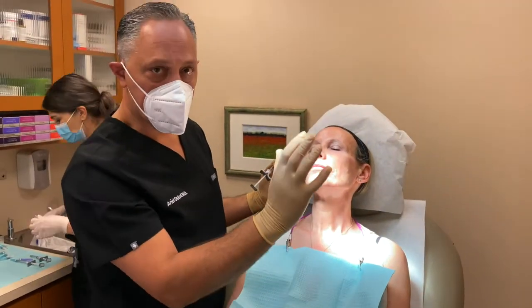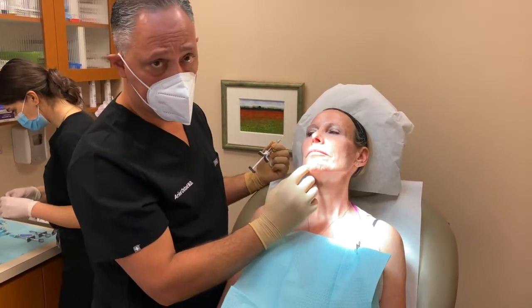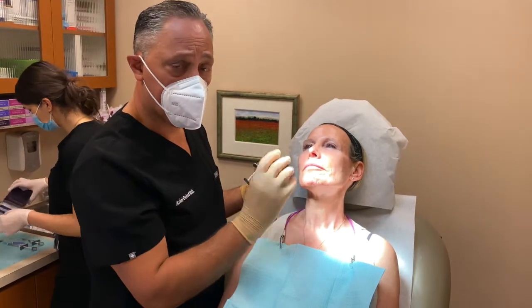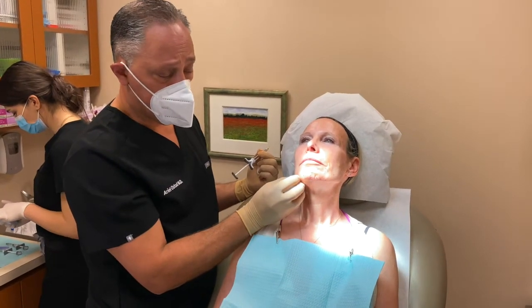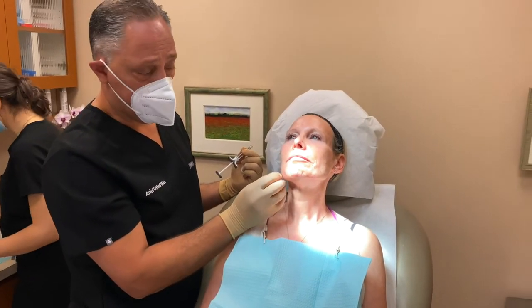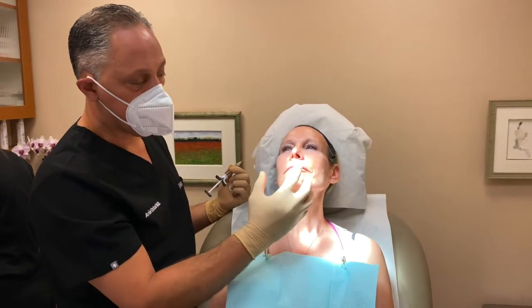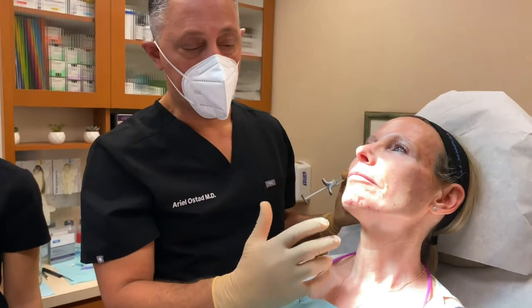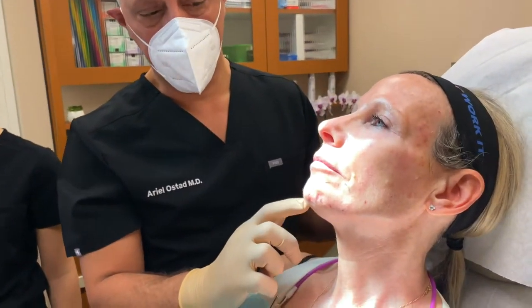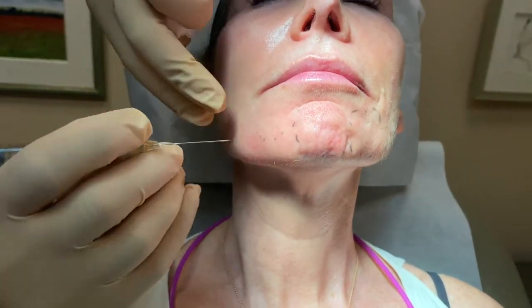I don't want to make this too scientific, but the chin is really divided into different subunits. There's the mid-chin, there's what we call the lateral chin, and then there's what we call the prejowl sulcus, which is kind of this area here. Now, some people are really hollow here, where because they've lost the support, they have like a pouch here. In her case, she doesn't. She looks great. But it's about really making sure that we're not just injecting this into the chin to create a bulbous chin. It's about really feathering it. It's really about defining it. It's about really going into each and every subunit. I really addressed her chin, her lateral chin, but we want to go into what we call the prejowl sulcus. And I'm going to use that same entry point.